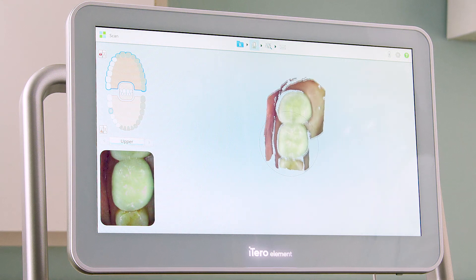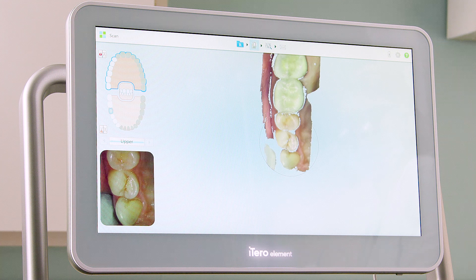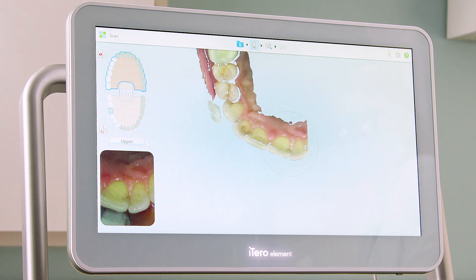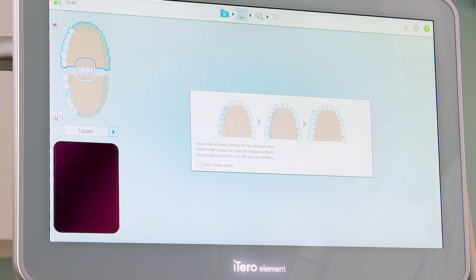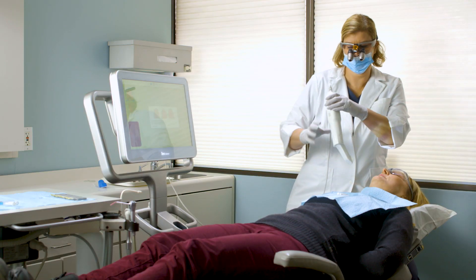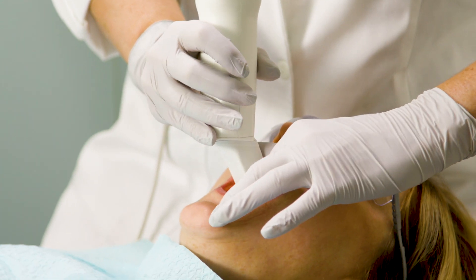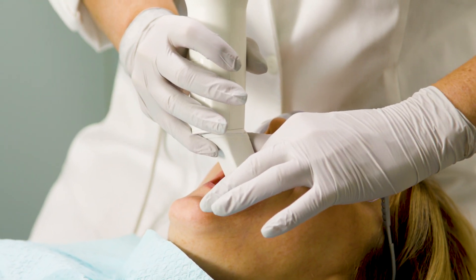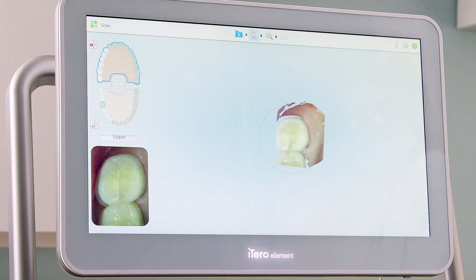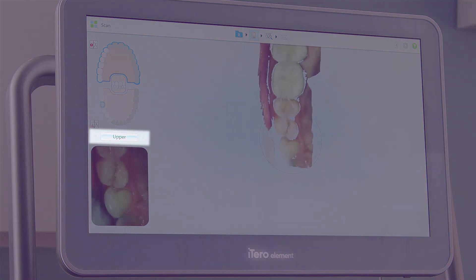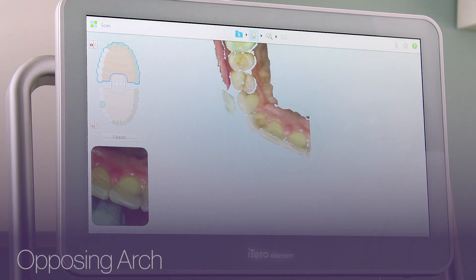To begin, I will scan the occlusal surface of the opposing arch segment, being sure to scan only the anatomy I want included in the model. The guidance hints will remind me of the scanning protocol for each segment. I will place the wand tip flat on the occlusal surface of the most terminal tooth, and once I have the tooth centered in the viewfinder, I will press either of the side buttons to start the scan. The blue scrolling bar in the segment indicator box shows that scanning is active.